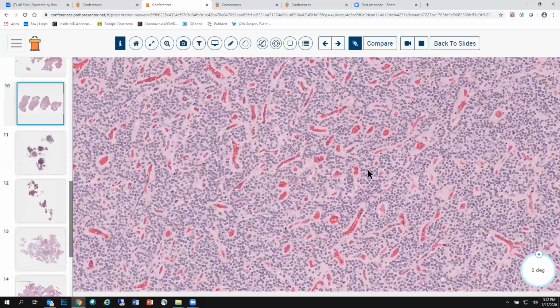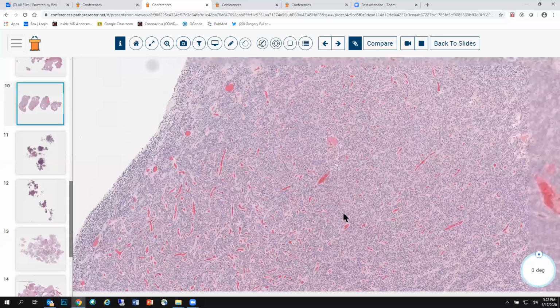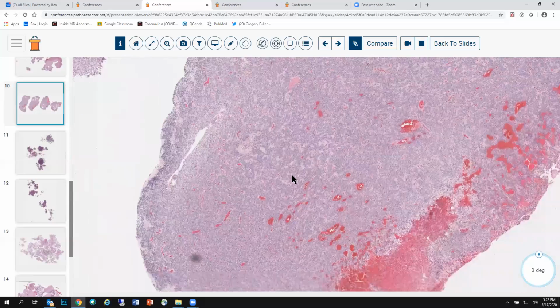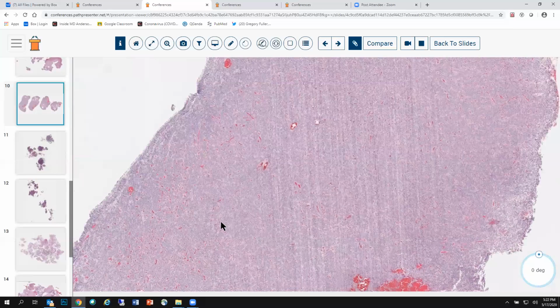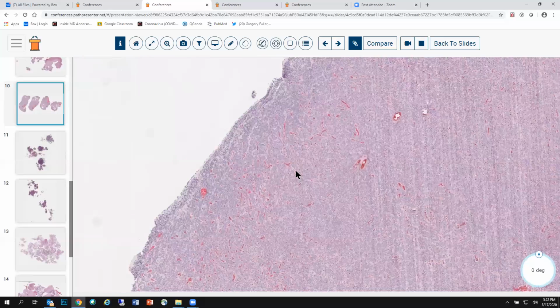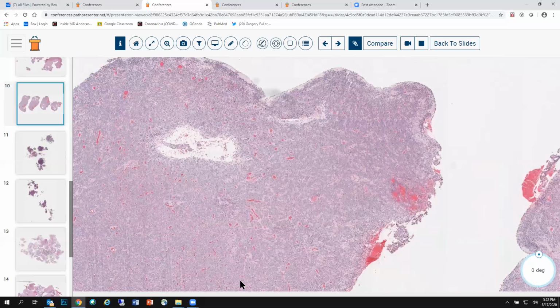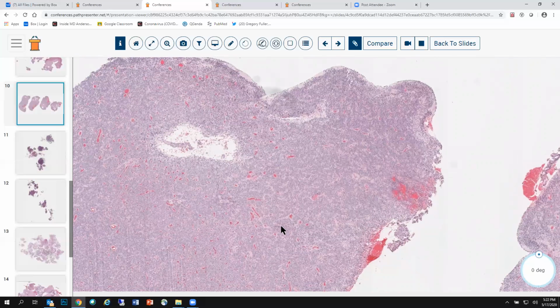Central neurocytomas are strongly synaptophysin positive, in contrast to ependymomas, which will not have that degree of synaptophysin positivity. Here's another clue. Look around at all the fragments. Can you find infiltrated brain parenchyma? Oligodendrogliomas are diffuse gliomas. They infiltrate the adjacent brain parenchyma. You're not seeing any parenchyma here, all right? Now, sometimes you will get the adjacent brain, typically from the septum at the foramen of Monro. That's where they originate. It will be a very short margin. You're not going to find infiltrated neuropil. You're not going to find secondary structures of Scherer, infiltrated cortex, etc.